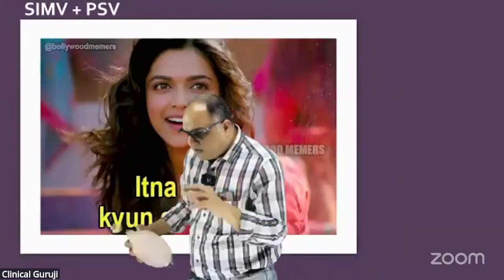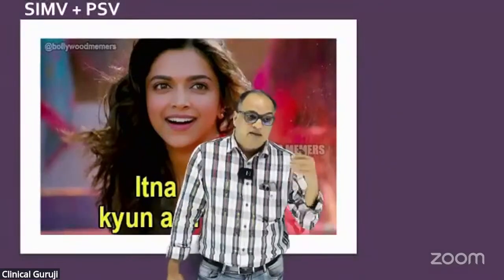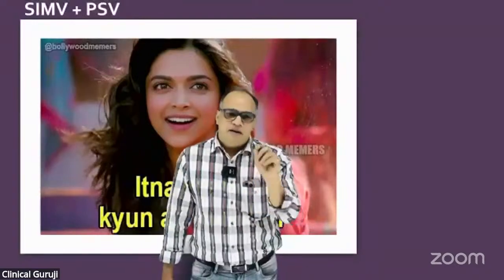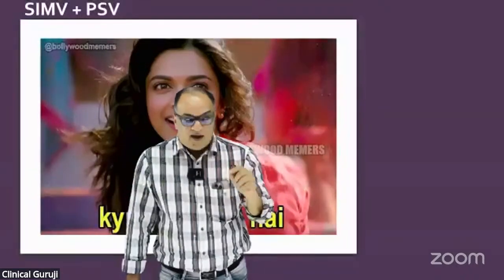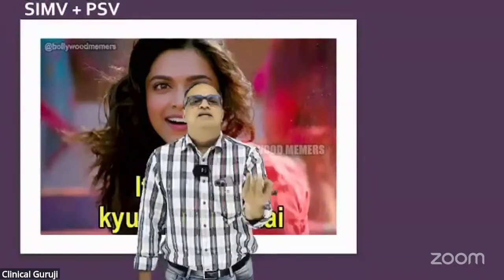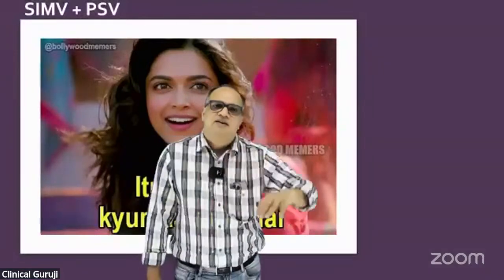So eventually this SIMV plus PSV has turned out to be the best mode to even initiate a ventilation, because if a patient is paralyzed and you have set 500 into 12, the patient will be getting the full 6 liters of minute volume. So it works as good as a CMV. If the patient starts breathing, then it will start working as SIMV plus PSV. So in a paralyzed patient, ACMV, CMV, SIMV plus PSV, they are all the same.